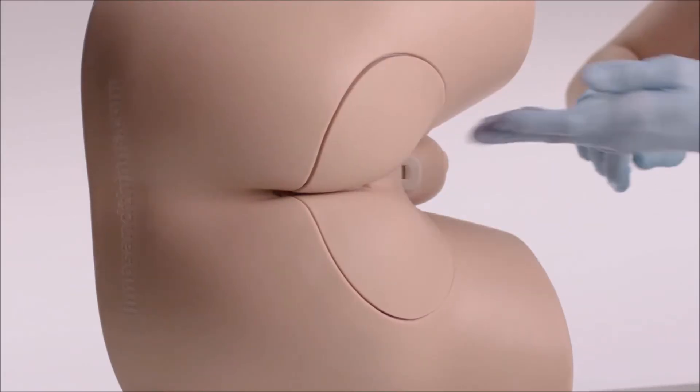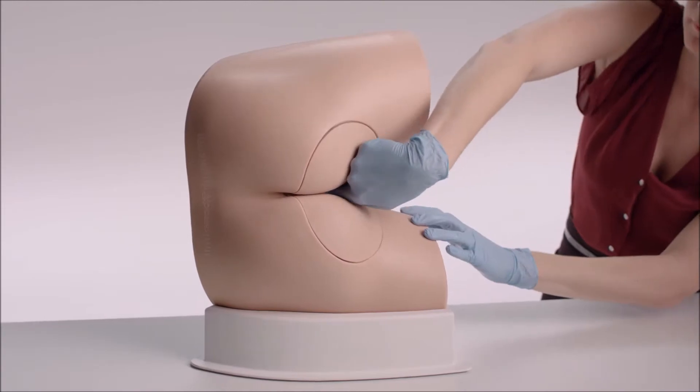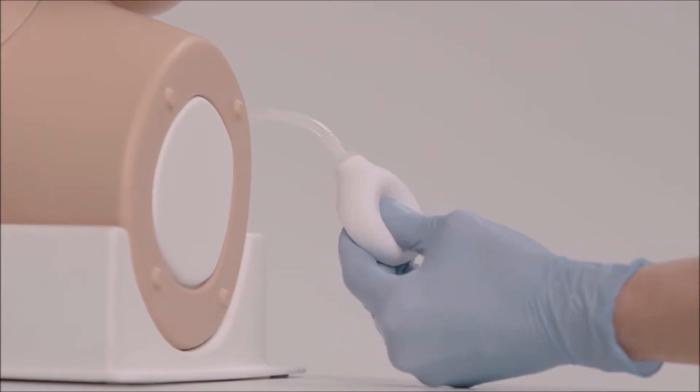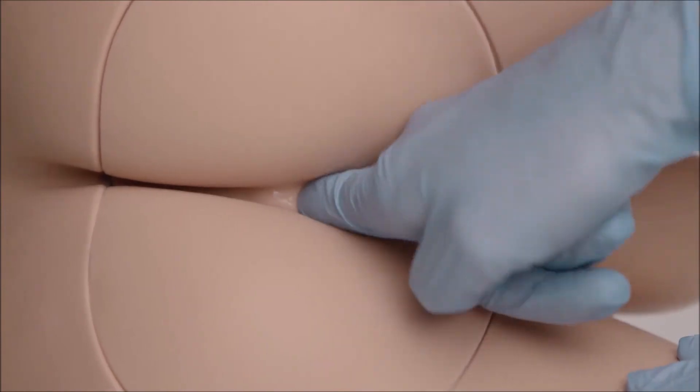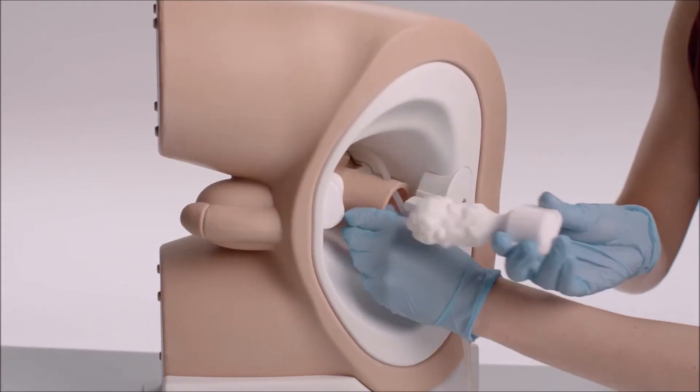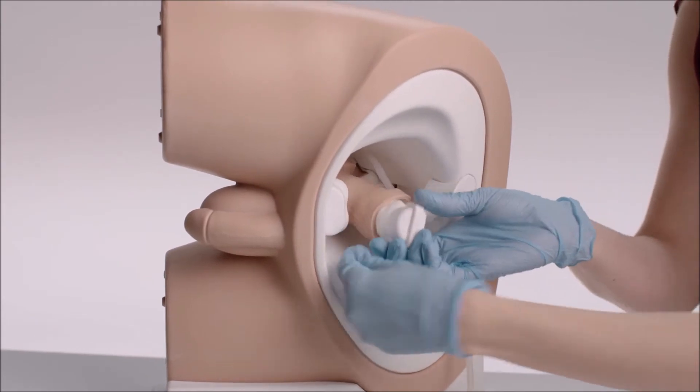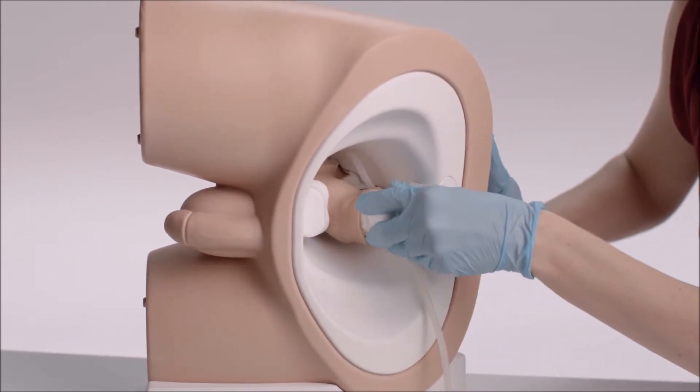Both the Advanced and Standard models feature soft, partible buttocks and a contractible anal sphincter, allowing the trainee to learn how to assess anal tone. Impacted fecal matter can be added in conjunction with any of the prostates to help students learn to distinguish this common finding.